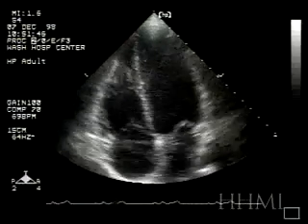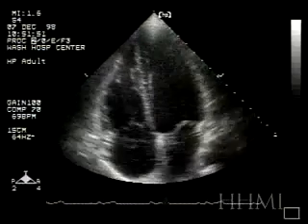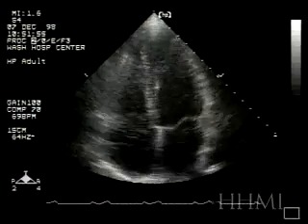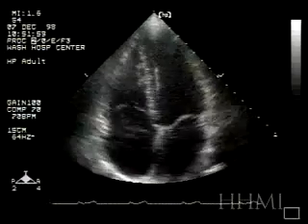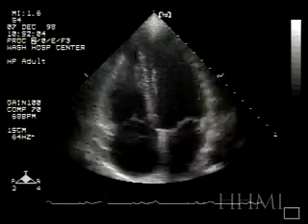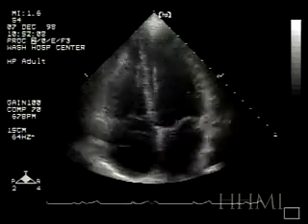The atrial ventricular valves are opening and closing. Here's the left ventricle sequentially moving, the right ventricle. And you can see the rhythmic contraction. As a cardiologist, we can ask whether there has been any damage to the left ventricle, such as from a cardiac event, a heart attack, and that would result in a decrease in the mobility of this particular wall of the heart.